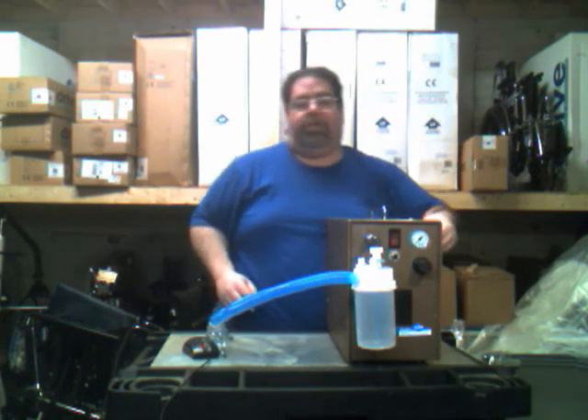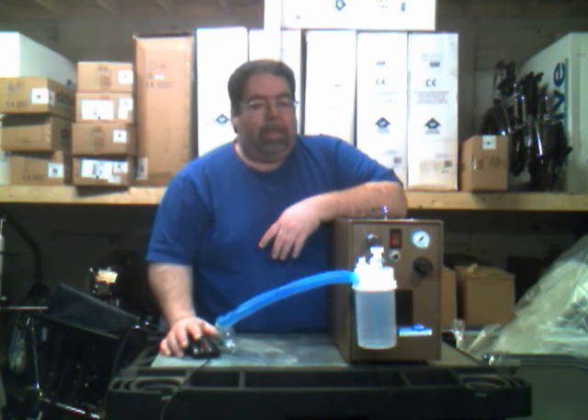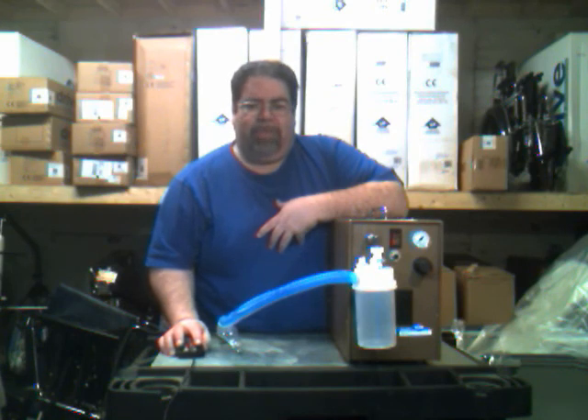It's not a very difficult machine to use, although some parts do take a little bit of experience to get used to. That concludes this portion of the In-Service Online with Approved Surgical Supplies. Thank you very much, and have a good day.